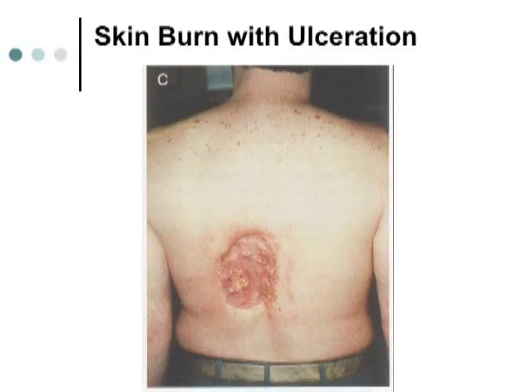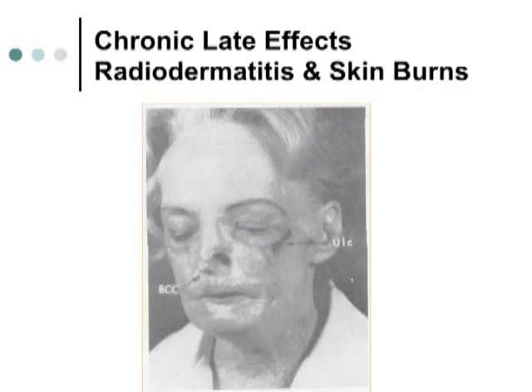This is 2 months out. Okay, and it went through a series of stages, started with erythema, and then moist desquamation and blistering, and ultimately ulceration, and then finally skin graft. But somebody's going to pay for this mistake, and it's not going to be the patient. But yes, it can be harmful if you use too much of it, if you don't know what you're doing. So hopefully by the end of this talk we won't have any problems.